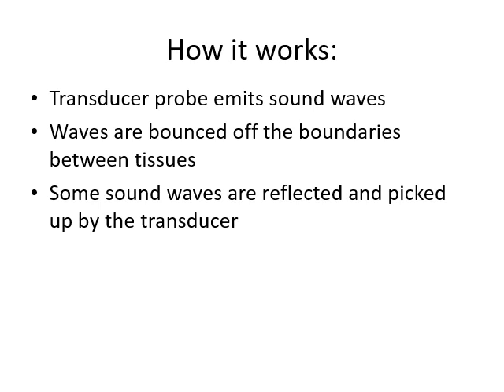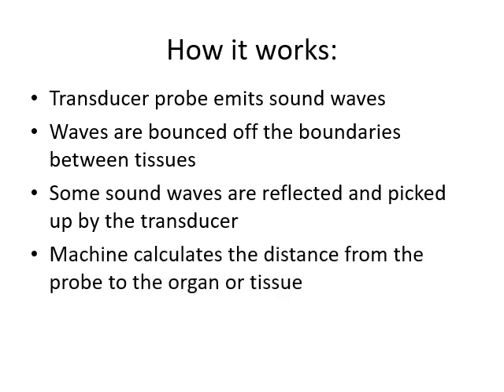So the transducer is sending the energy out, the sound energy out, and also picking up the echoes that are coming back. All right, and then again, we could just jump through all the physics. What ends up happening is the machine or the computer that the transducer is connected to calculates the distance from the probe to the organ or the tissue. So it's going to calculate the distance here, and then form an image onto a screen.